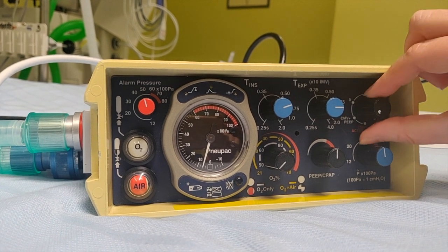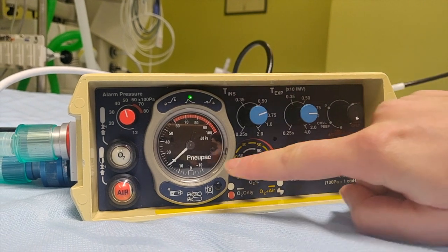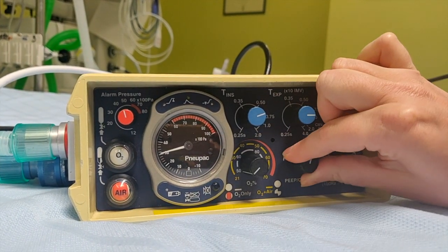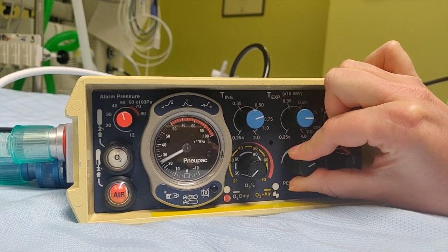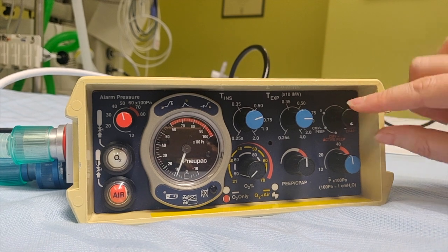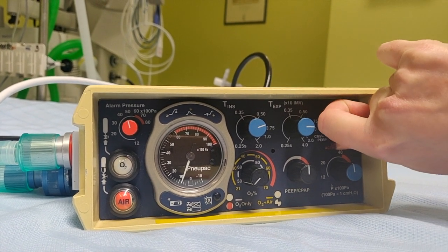Just so you see — if we change that to active PEEP, because there's much more flow, the PEEP will suddenly increase. So now with that setting we're delivering 10, and it can go much higher. Just be mindful: if you do change to active PEEP because you have leaks, your PEEP settings are going to change.